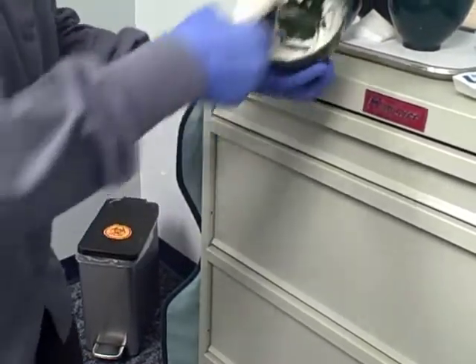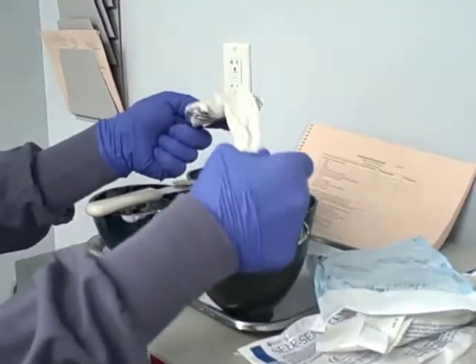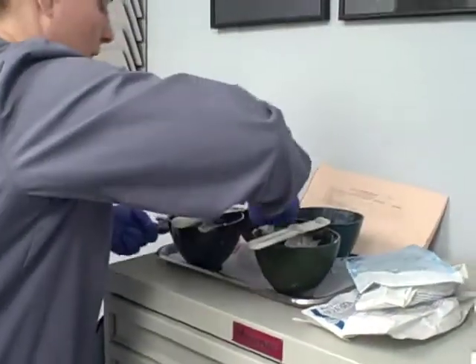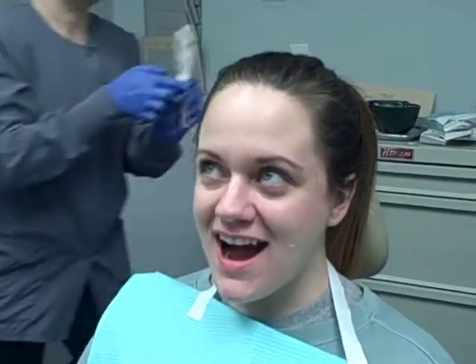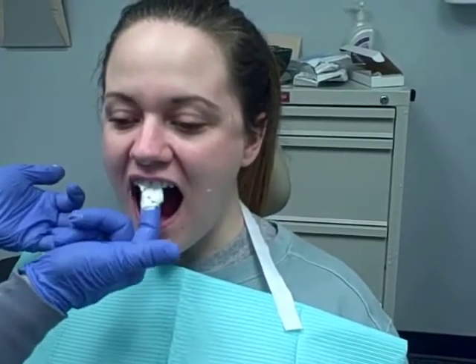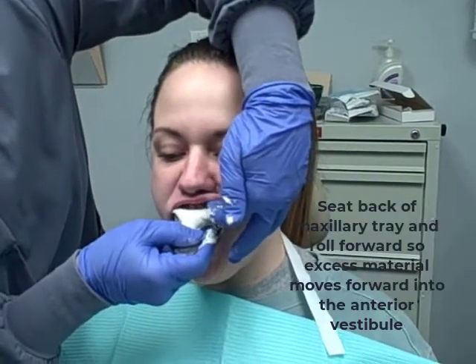Until it's nice and smooth, without bubbles — there are a few bubbles you can get in there. I'm going to put it in the tray, more towards the front of the tray. And when you get the gauze, I'm going to dry off your teeth. I'm going to put a little bit on the occlusal surfaces. We're going to stand from the back and put this in. I'm going to set the back first, and then roll it forward.